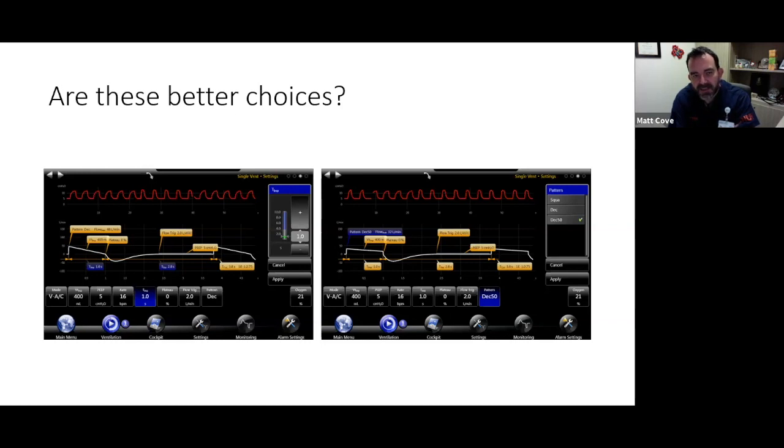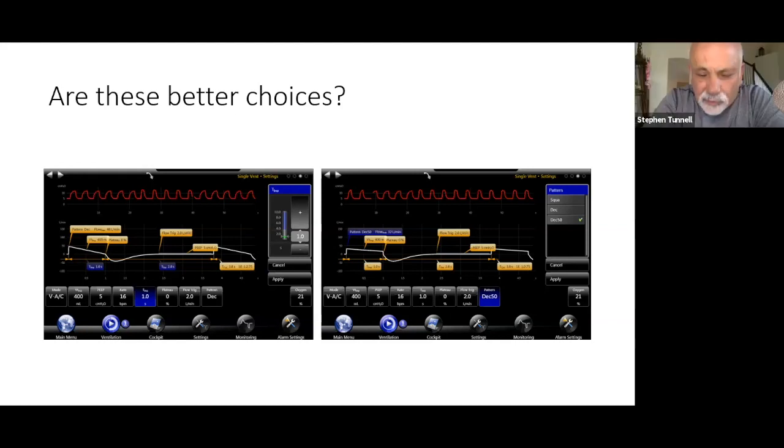So I guess it's not something I'm aware I could modify, so it's not something I've thought about. Yeah, that's okay. No issue at all. I mean, like Steve said.